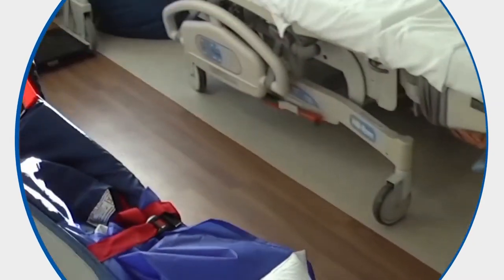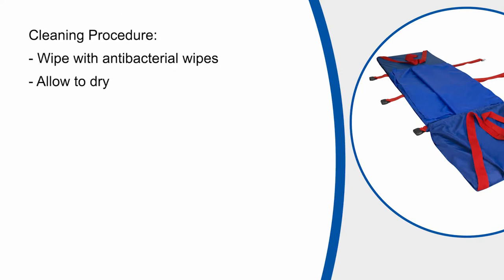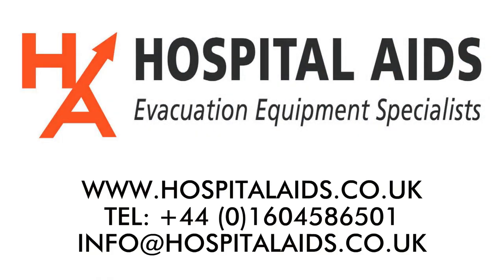Once the user has exited the building and reached a point of safety, the straps can be loosened to ensure the user is comfortable. The ski slide pad can be wiped over using antibacterial wipes. Ensure that it is dried thoroughly before storing back into its case.